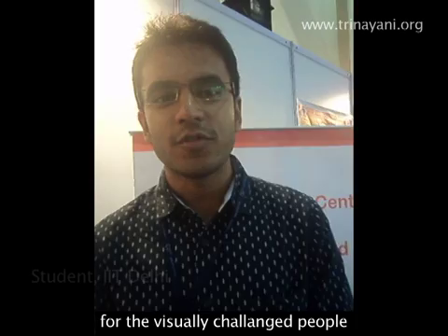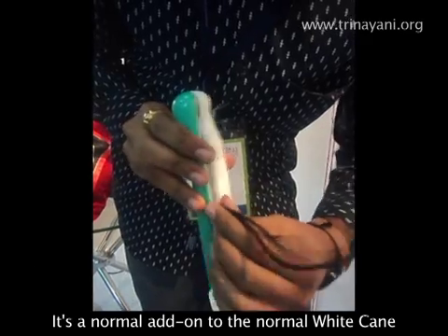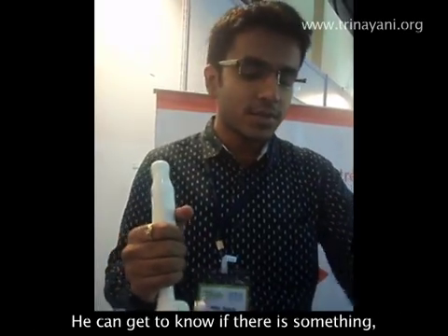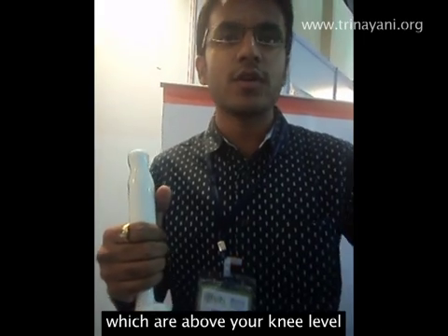We are making technologies much more accessible for the visually challenged people. One of the products in the market is a smart cane. It's a normal add-on to the normal white cane that people are using. If there is a person walking with a normal white cane, he can get to know there are stones on the ground, but he won't be able to identify obstacles which are above knee level.